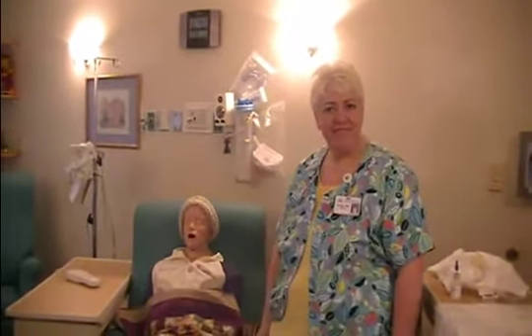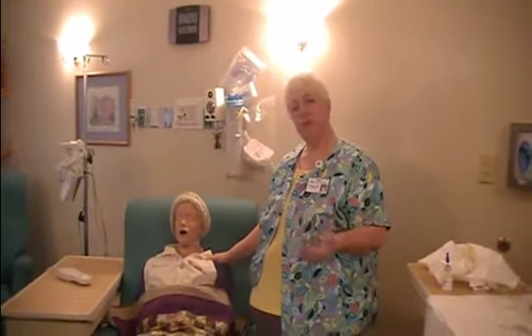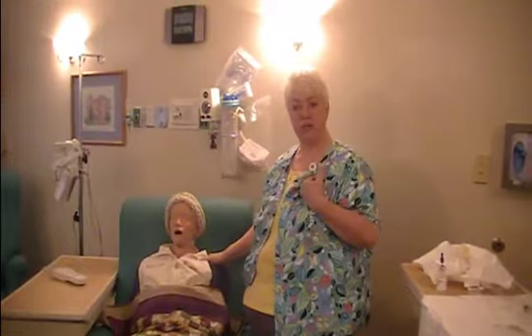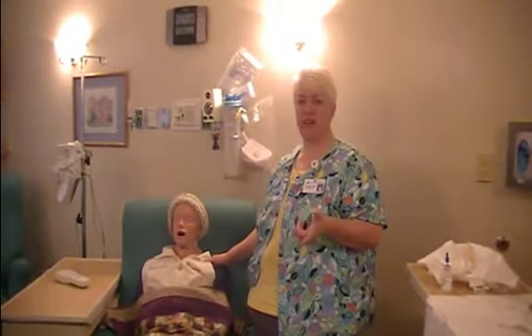Can you tell us what you just did and why you did that, Cindy? Well, I want to know where the patient's at with the situation — if they're an experienced patient that knows what a port is for and why they're here. And I want to know that they know what to expect.